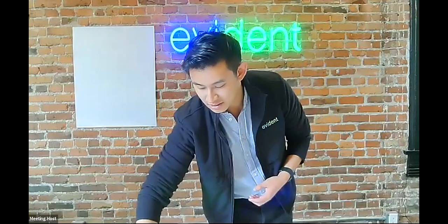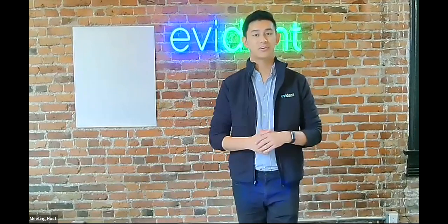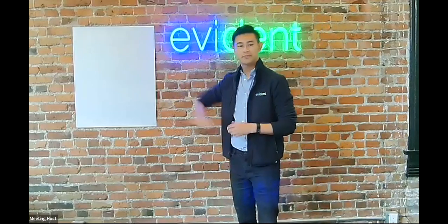You'll also need a cheek retractor. Great, so to get into the setup process, first you want to find a white background or a wall. As you can see behind me here, we have a brick one, so we don't have a white wall. A backdrop will work great, just like this one.